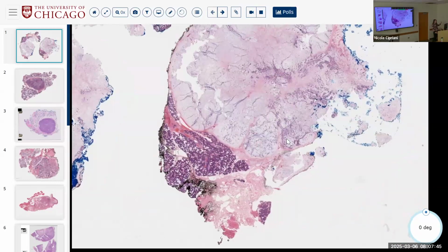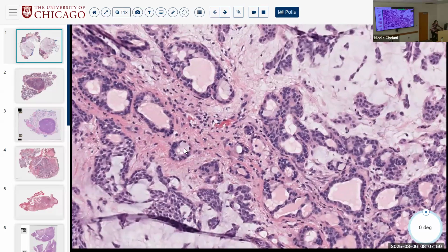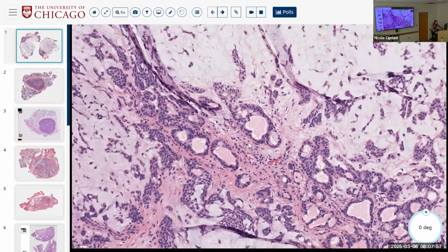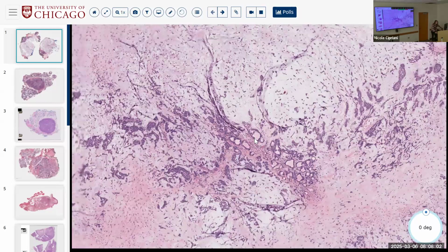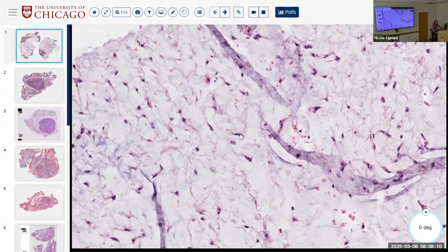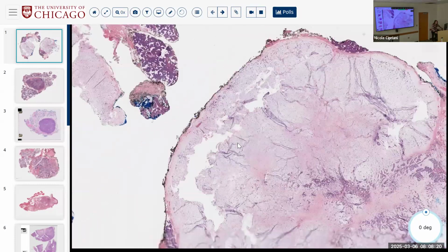A pretty conventional kind of diagnosis where, as pointed out, you do see bilayered ducts, right, with the myoepithelial cell layer at the periphery and epithelial cell layer at the center. These are within the center of the tumor, so these are neoplastic ducts, not sort of entrapped at the periphery, so that's always helpful. And yes, myxoid, but not necessarily chondroid background. These individual cells are probably of myoepithelial phenotype, and they're the ones that are secreting this connective tissue kind of mucin. So that's fine. No atypia, margins look kind of shelled out, but otherwise okay.